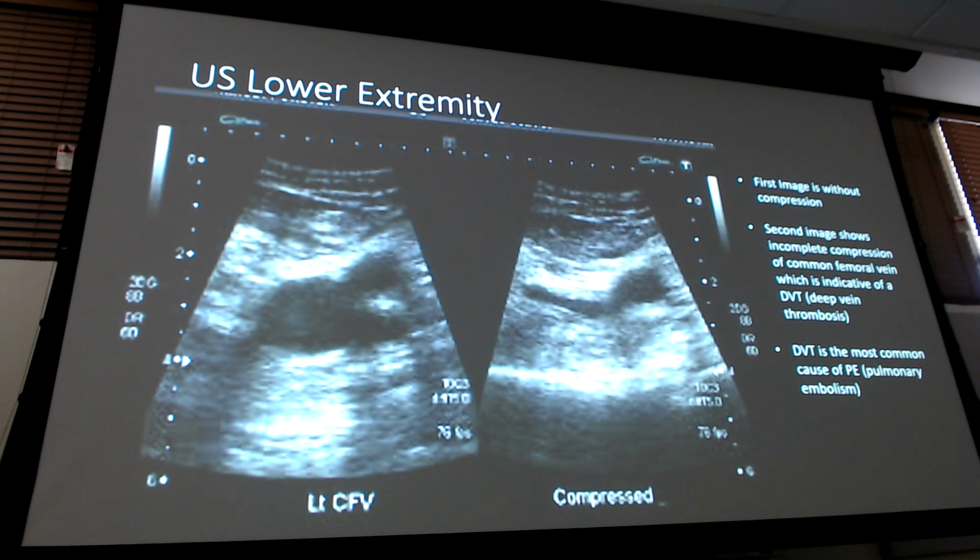But again, when am I doing this? I'm doing this in my pregnant patients when they have leg pain. Where does it hurt? One finger. Can you point to me where it hurts? Oh, right here. Great, that's where I'm starting. Right? So that's kind of what you would do if you were actually doing it in clinic. Okay, questions on that?